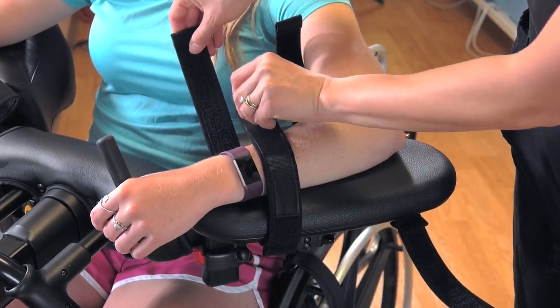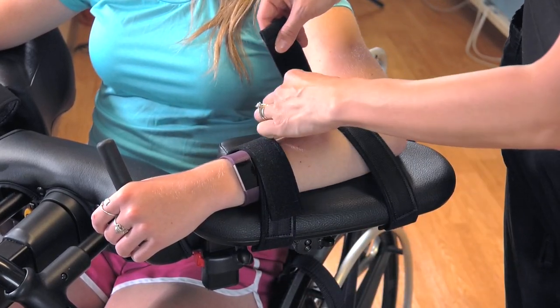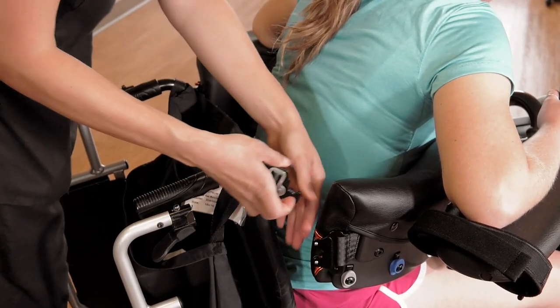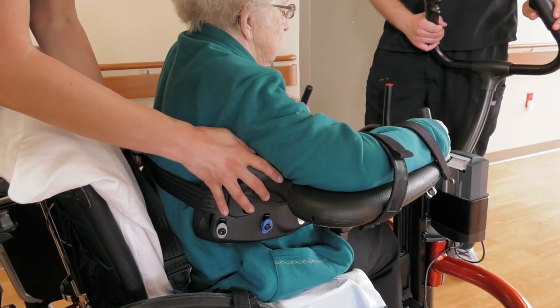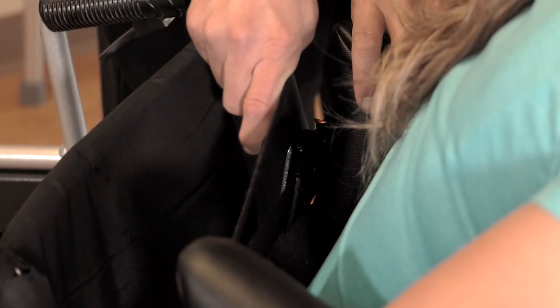Place the patient's weaker arm on the arm platform and fasten the strap. Have her place her own stronger arm into the other arm platform. Buckle the back of the trunk support. Tighten the strap until it feels secure but not too tight — the patient should be able to inhale without restriction.